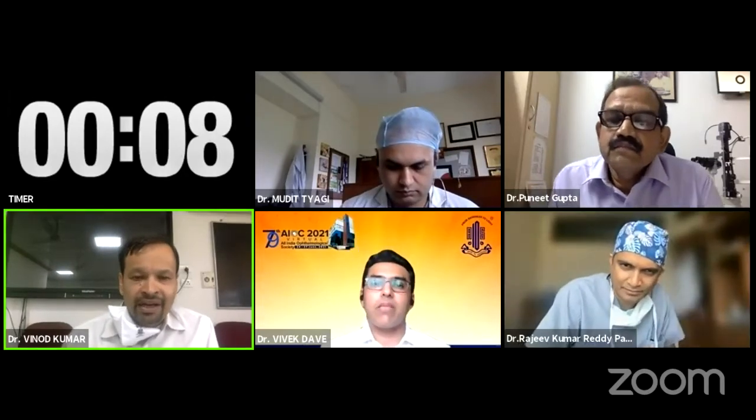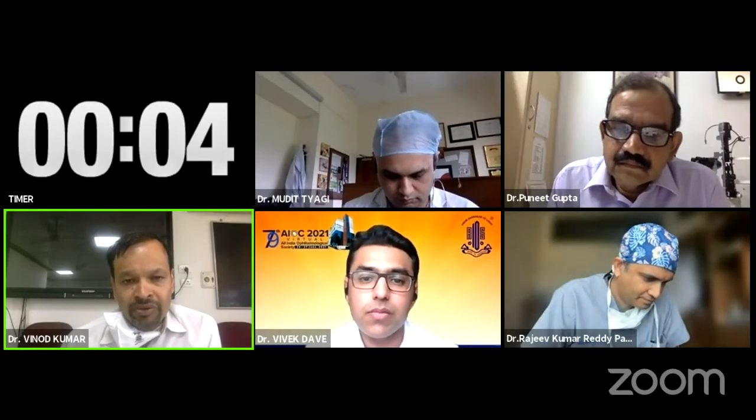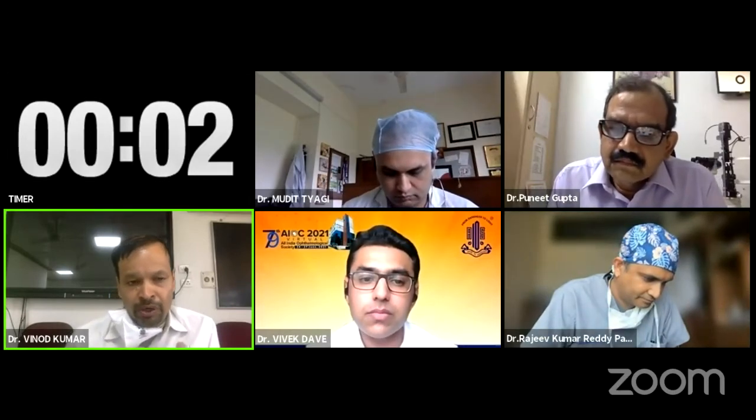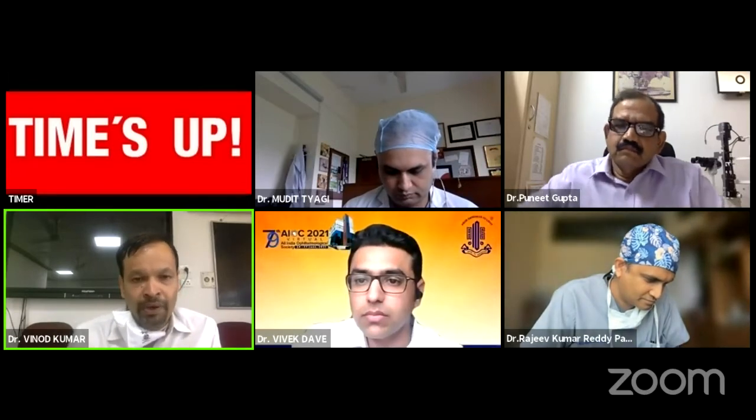I think the major difference between what we do from the microscopic system and endoscopic system is that your depth of view is very, very limited in endoscope. While your light is far away, you can still see a lot of depth, but with endoscope, your depth of view is very limited.